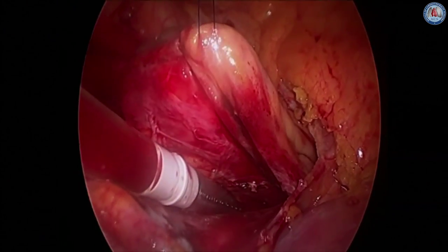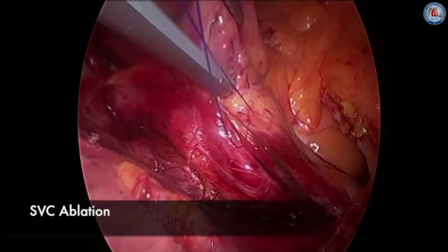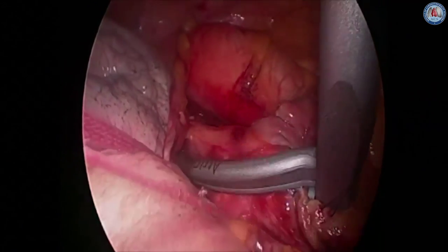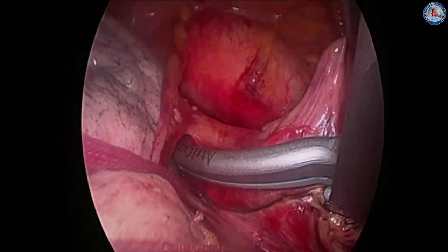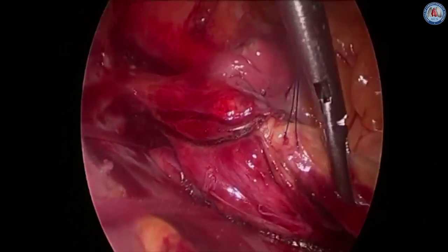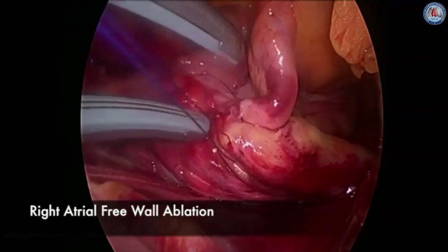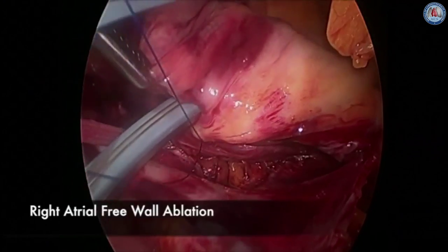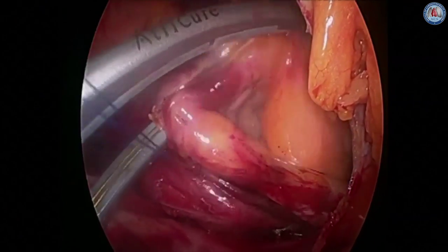The ablation lines are seen extending down onto the inferior vena cava. The clamp is then passed through the same purse string suture and placed superiorly up along the lateral aspect of the superior vena cava. The clamp is fired two or three times to ensure adequate transmurality. That creates a line of block from the superior to the inferior vena cava. The clamp is again placed through the same purse string suture and used to create an ablation line across the right atrial free wall toward the atrioventricular groove, approximately at the free margin of the heart.